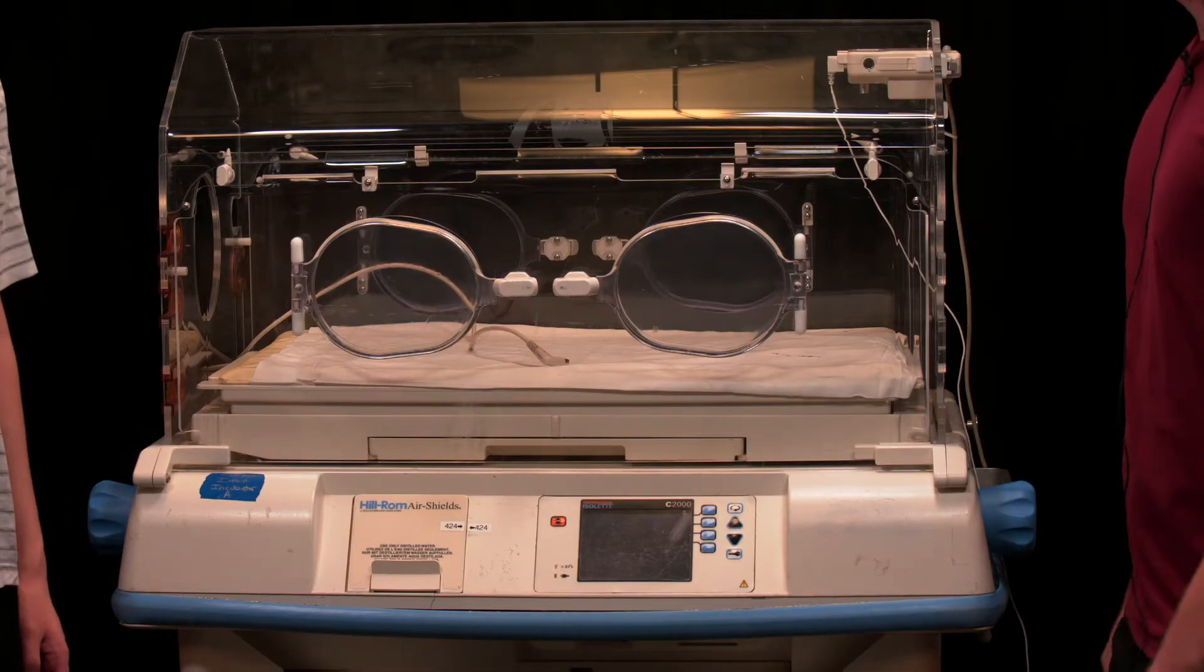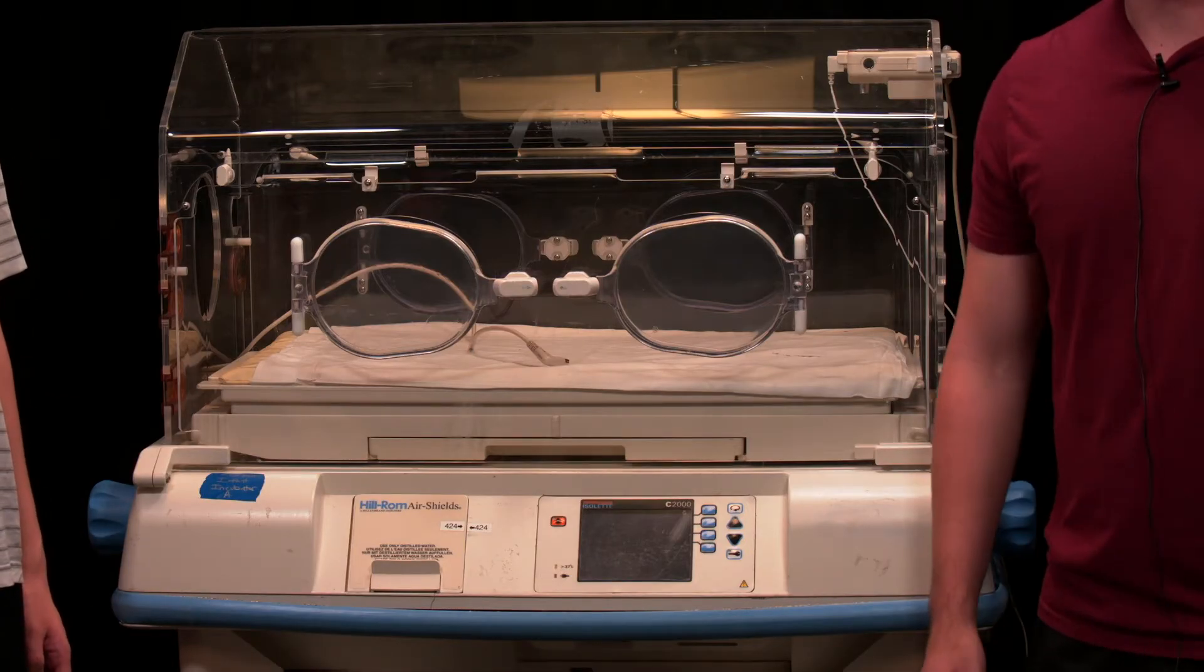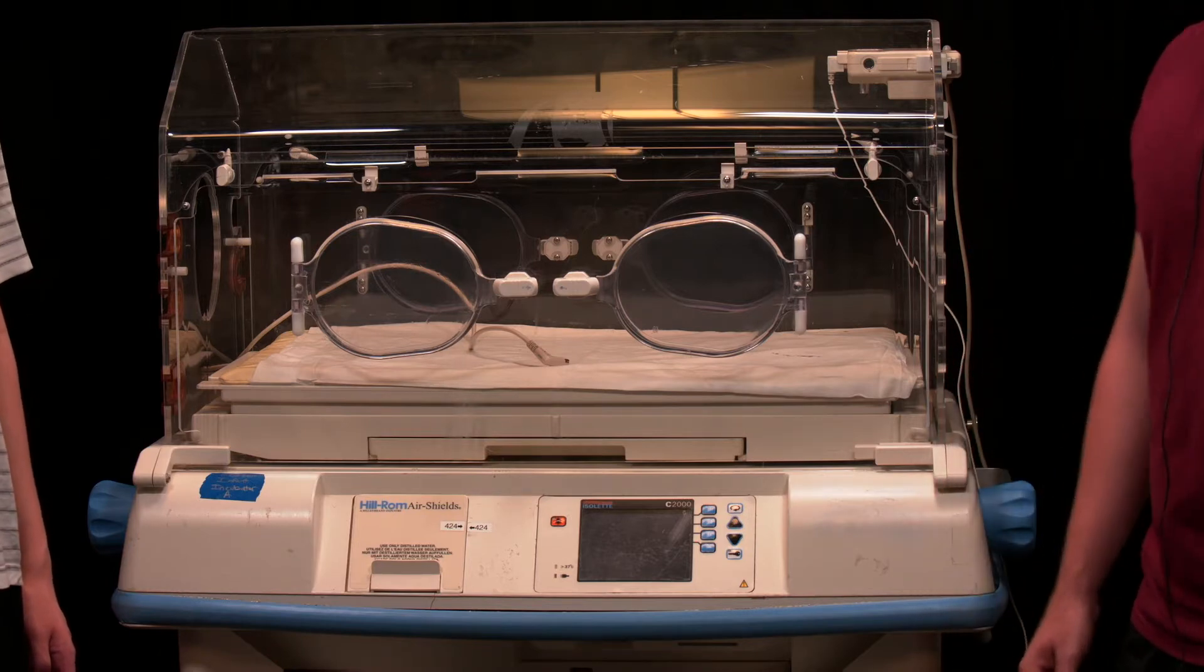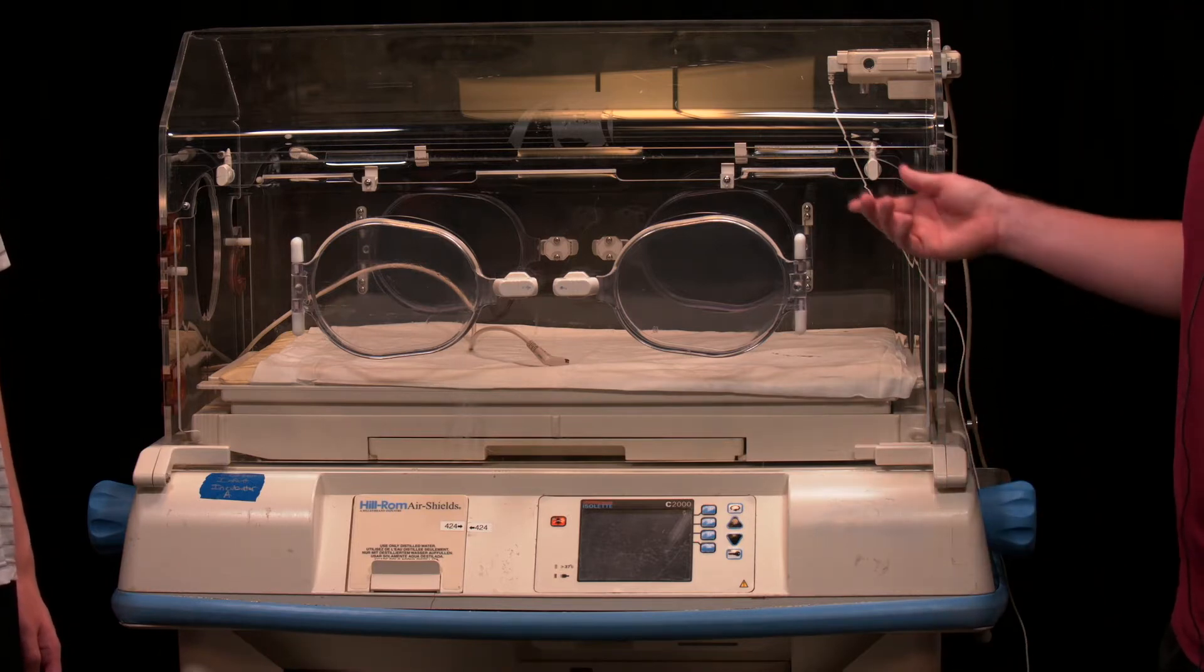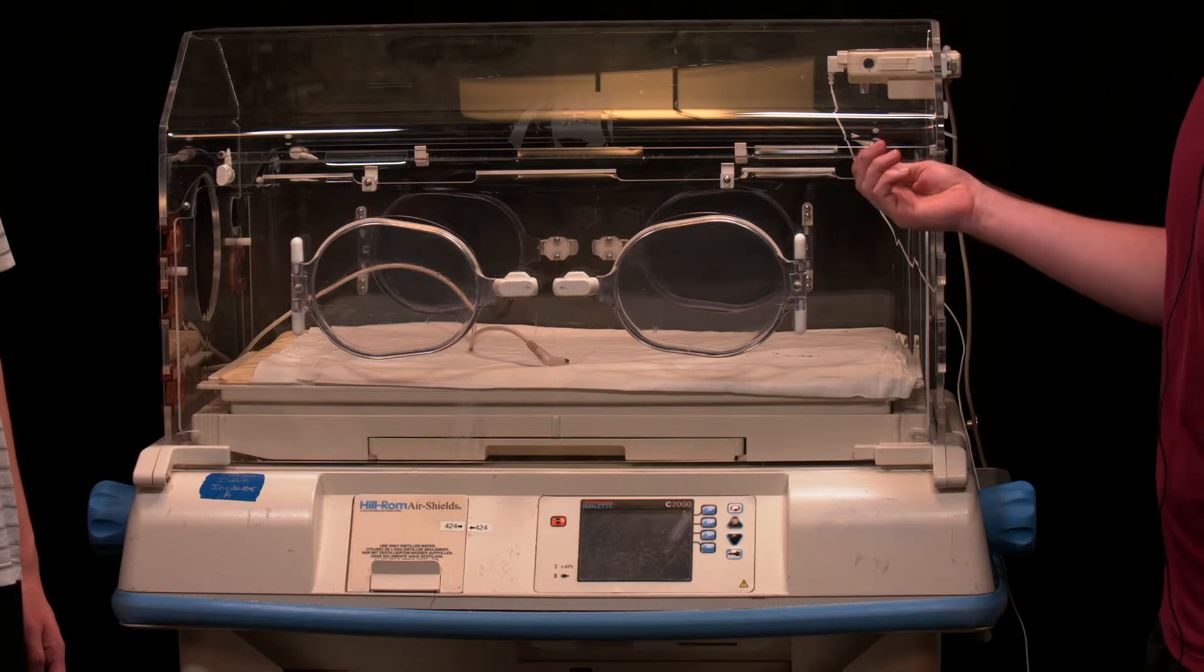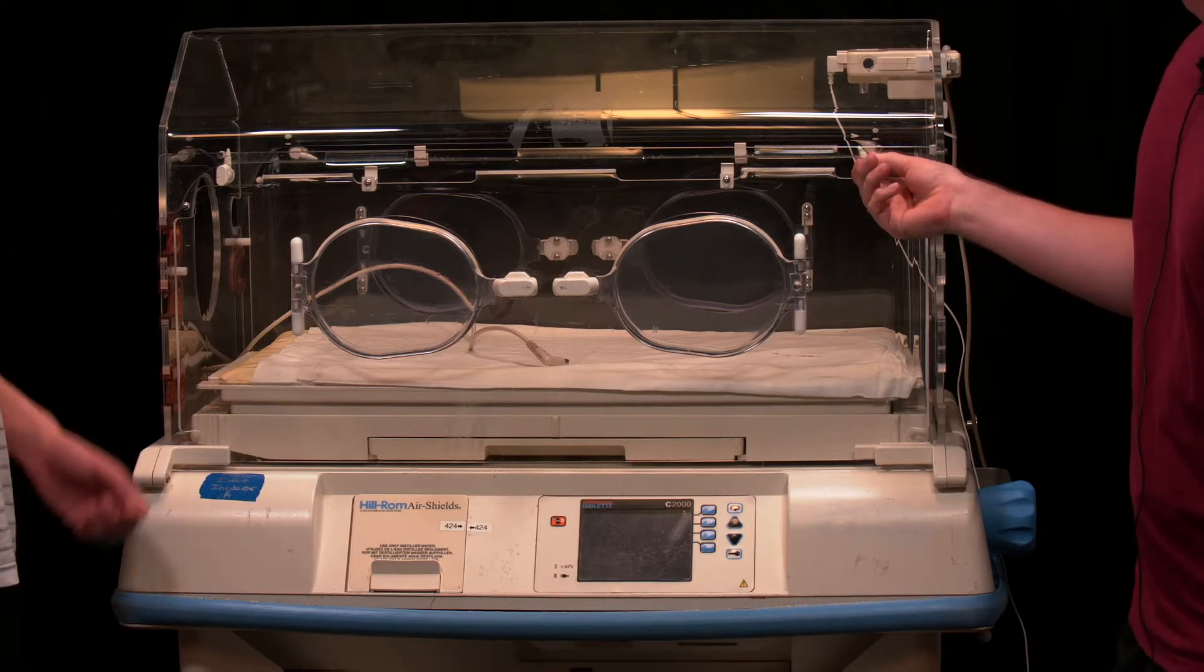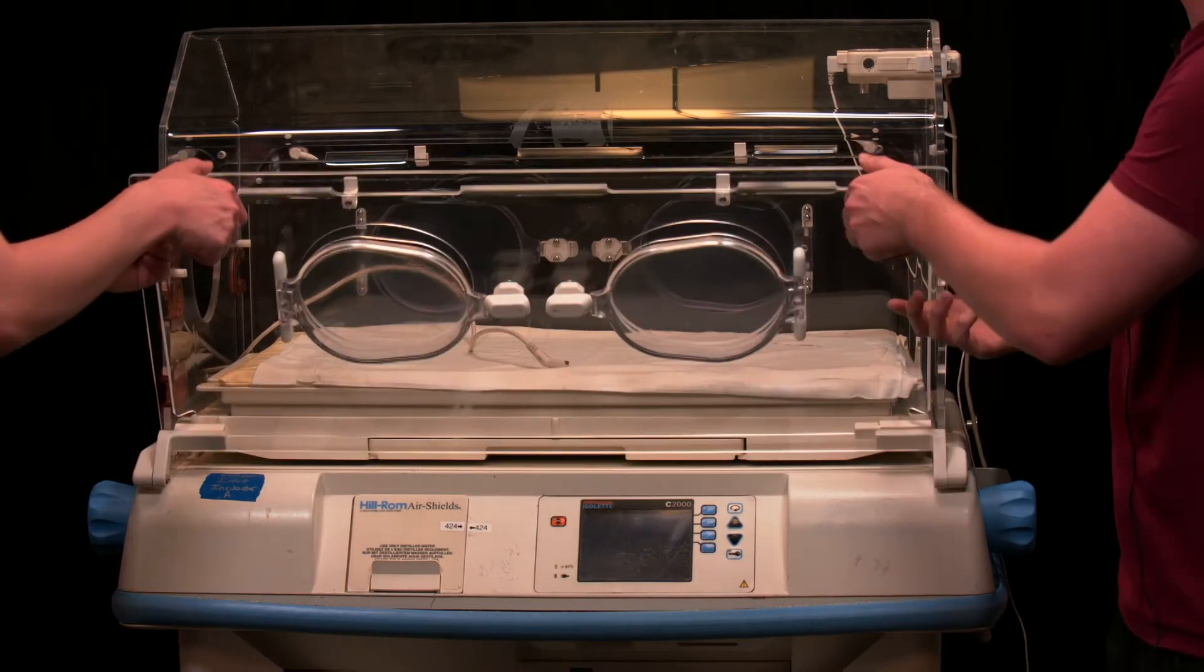First thing you've got to do when working with an electrical device is to unplug it before you open it up. The next thing we've got to do to start getting to the heater impeller is to unscrew the latches in the front. There we go. And then pull down the lid.